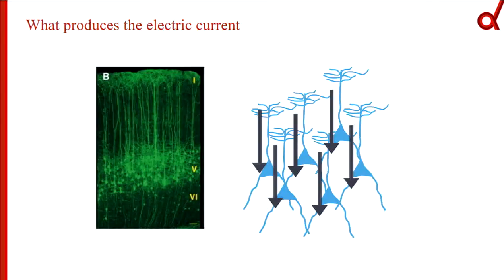Okay, why did I show you this video? That's what we're going to do, source reconstruction. A little bit about how to model a source in the brain. What we see here, what we always see today in the morning, are the pyramidal tracts of the neurons. When in these tracts we see some signal, we basically have some activity in this direction when it's firing. That's what we would try to model.